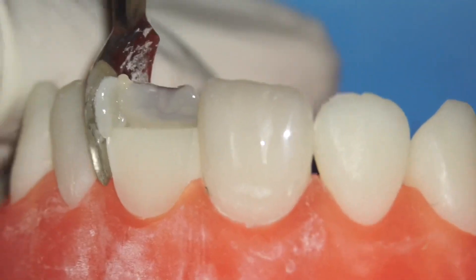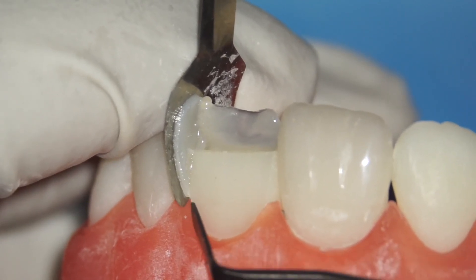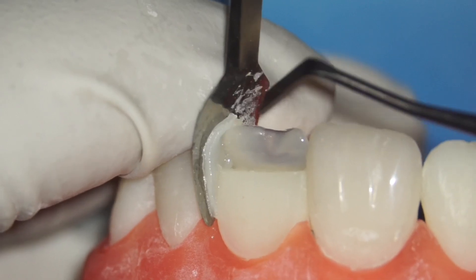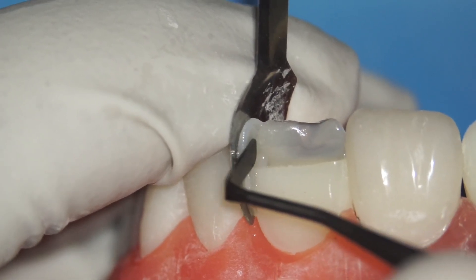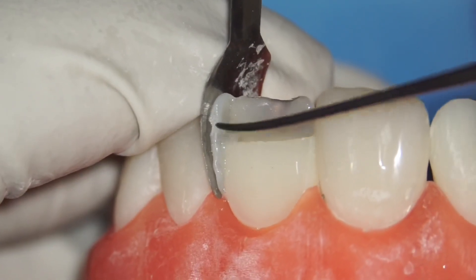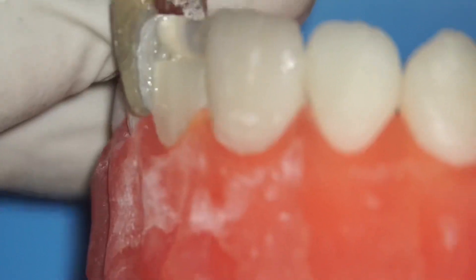I've only placed a small amount of composite but I'll use my plastic filling instrument to really compact it. There should be more composite in the middle third, because the middle third is the thickest part of the tooth, and then it should curve in near the incisal edge and the cervical edge. Any excess composite can be cut off at the incisal. You can also use a sharp instrument to get a better line so it adapts more precisely. Check palatally and remove any excess.